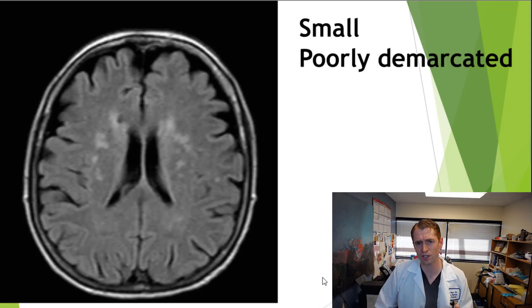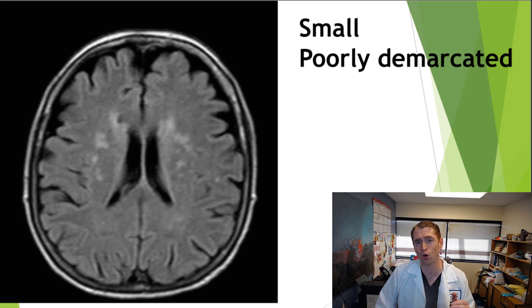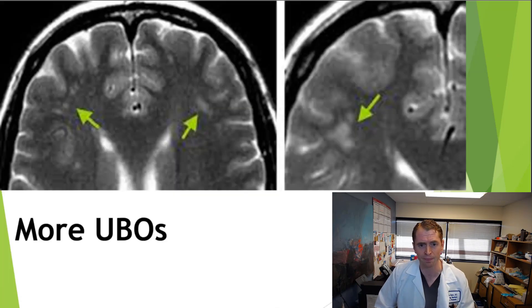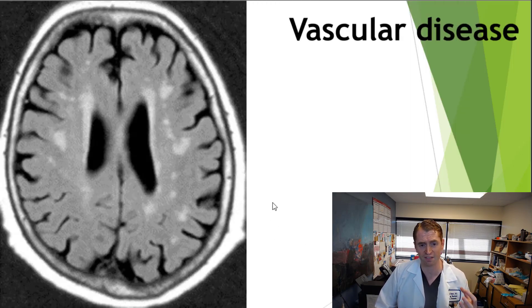Just because lesions are not typical of MS does not mean they're minor or insignificant — they can actually be quite impressive on MRI. You can see quite a few patchy, indistinct lesions, very patchy and poorly demarcated. Here's another example in the frontal lobes almost becoming confluent. Here you can see quite impressive vascular disease that can involve the periventricular area a little bit, with frontal lateral ventricle horn capping, typical of vascular disease.